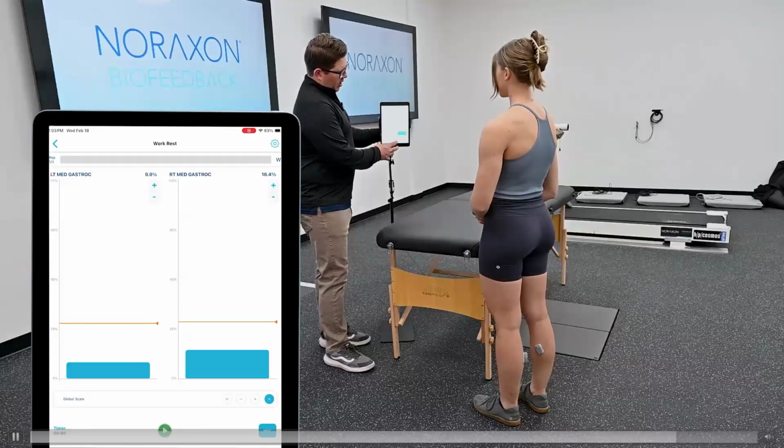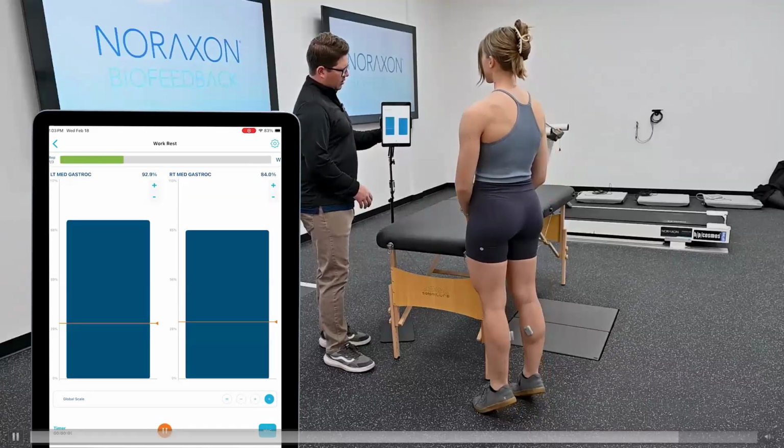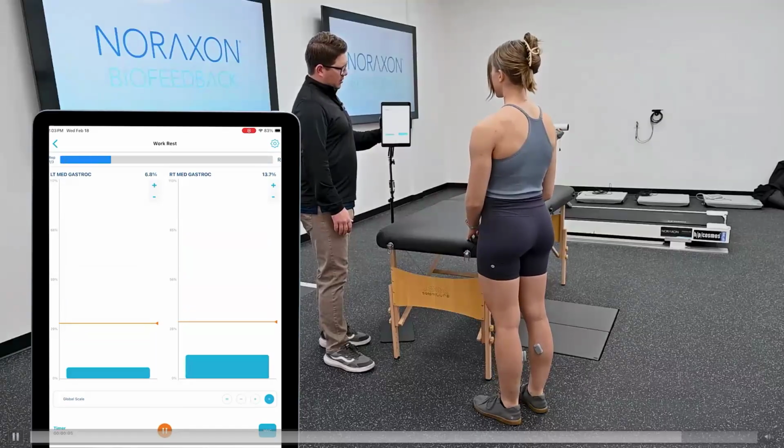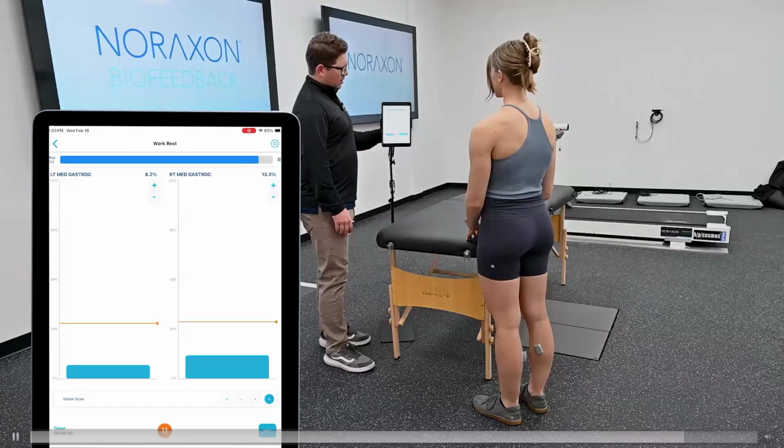Got it. All right, in 3, 2, 1, contract and hold and relax. Contract and hold here in a second and go.